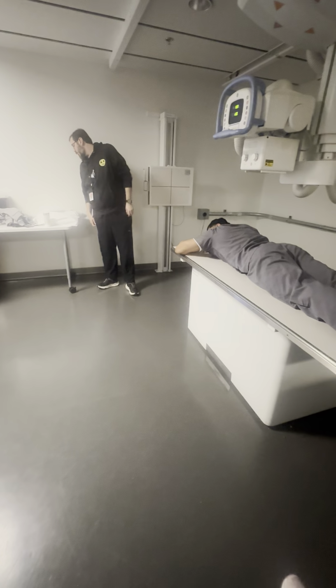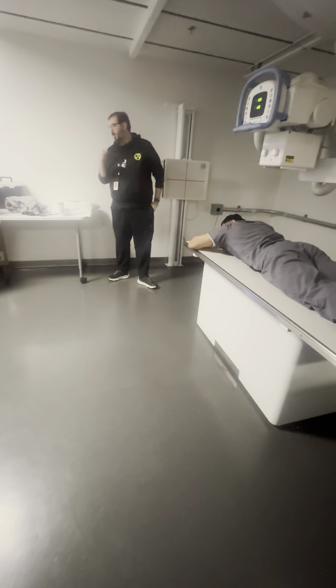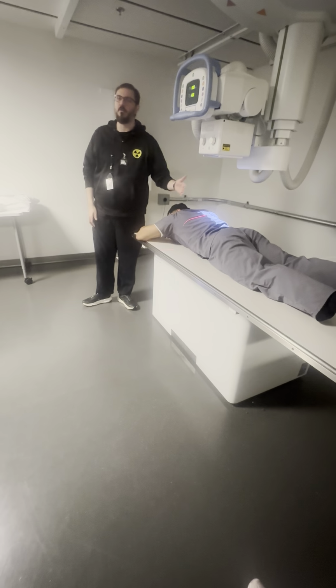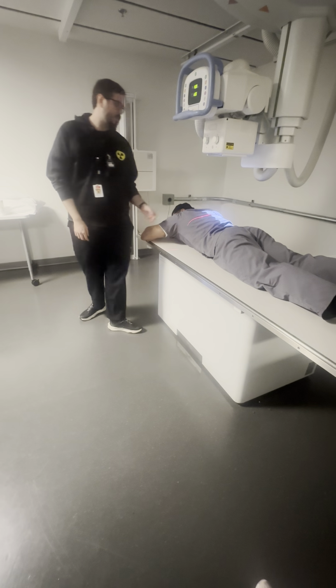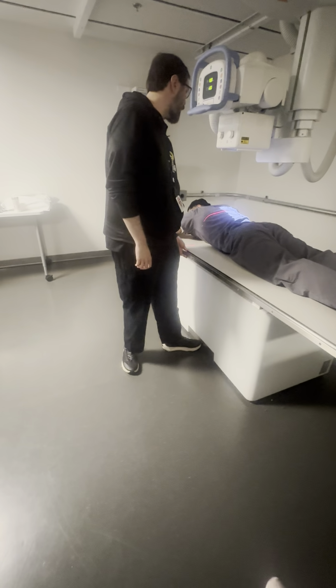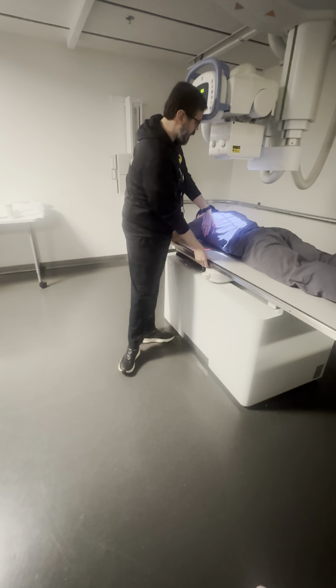So it says 1 to 2 inches above the lower rib margin, or level 1 to 2 perpendicular. It's basically the exact same shots we just did, except further to the left. Whereas for the esophagram you were slightly to the left, here we're going to be well to the left. So find this, come down about a hand.